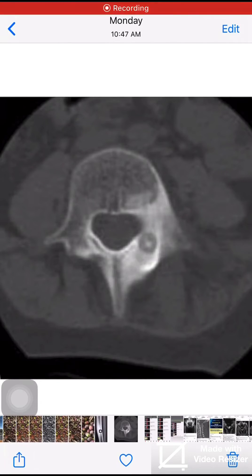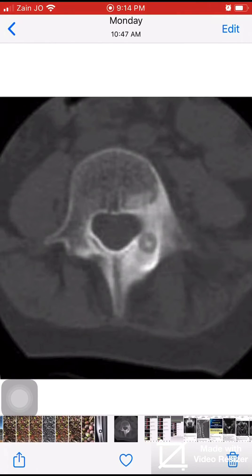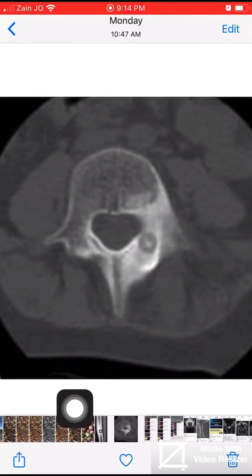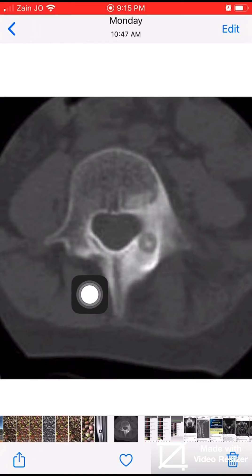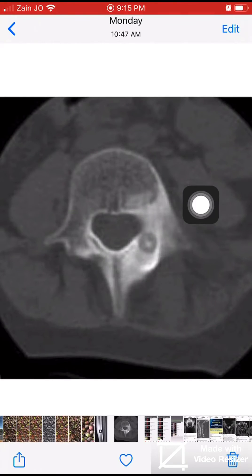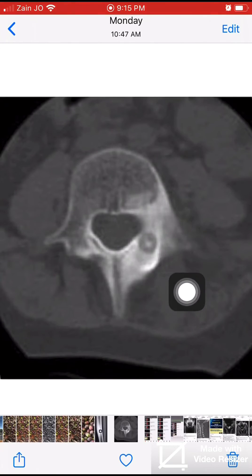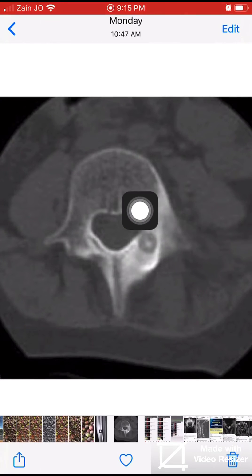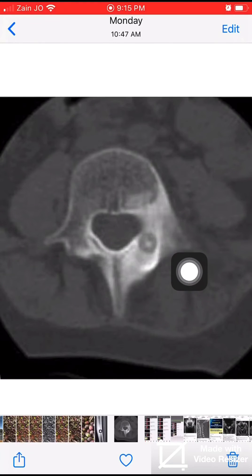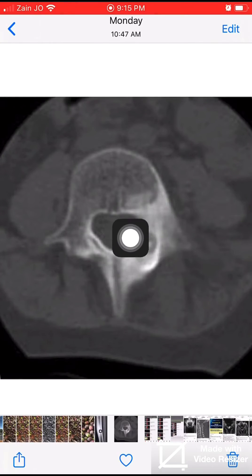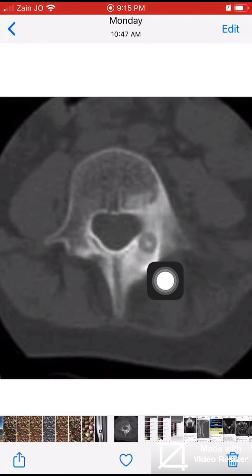As we see here in this axial CT scan image of the spine, we see a typical case of osteoid osteoma involving the posterior neural arch on the left side. It is less than one and a half centimeters, and the nidus — we see the nidus — is surrounded by sclerosis.